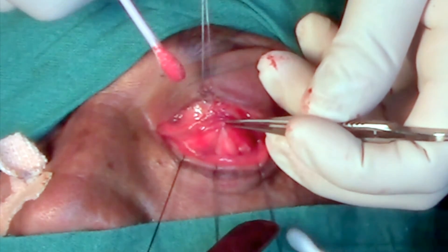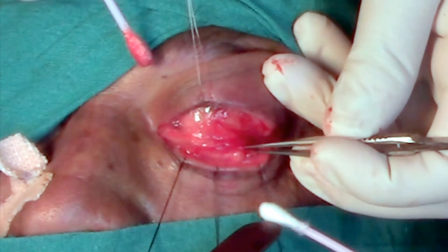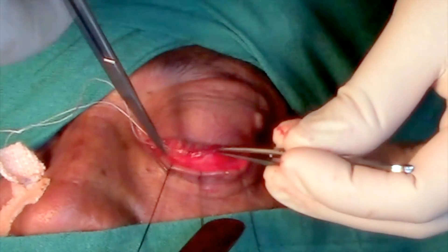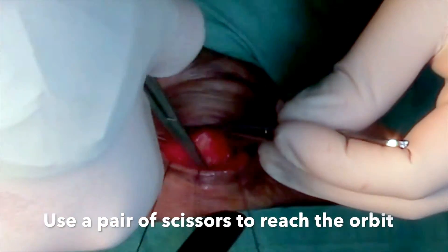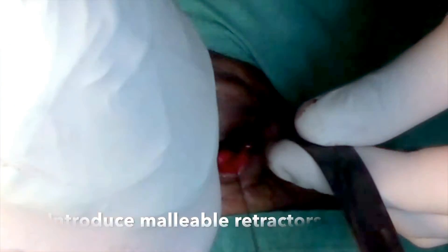Extend the conjunctival incision medially and laterally such that you can then visualize the lower lid retractors, which can also be incised using the cautery. Introduce a closed pair of scissors through the incision such that the tip rests just a couple of millimeters within the edge of the orbit and splay it open. Now you have reached the orbit.